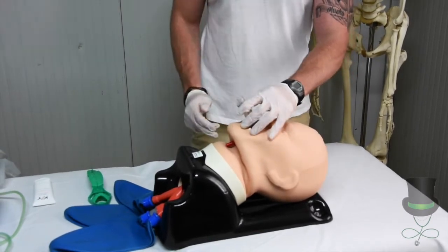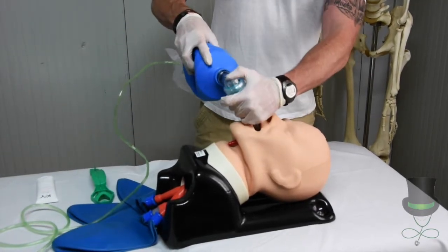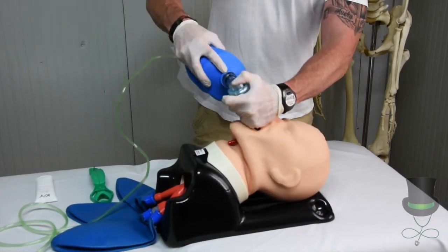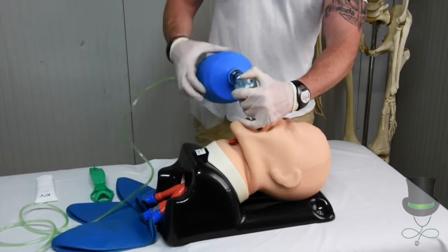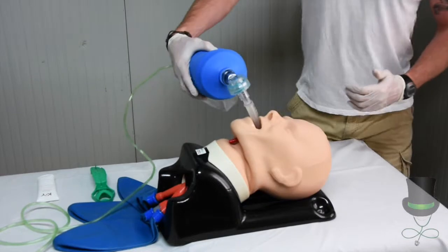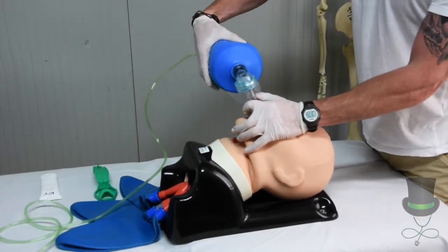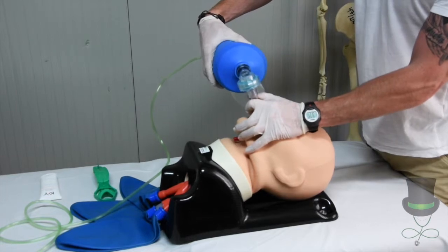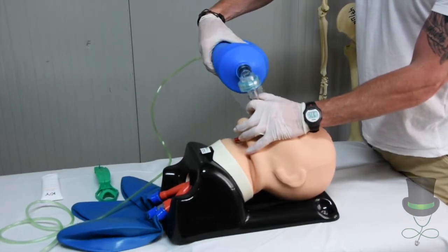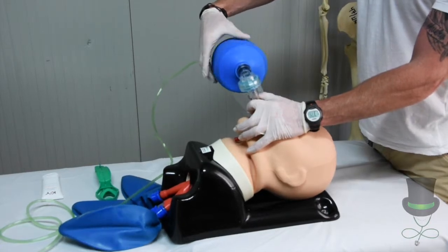Once the LMA is in place, take your BVM and attach it to the top into the port provided. Then perform a compression of the bag valve mask to ensure good air entry.